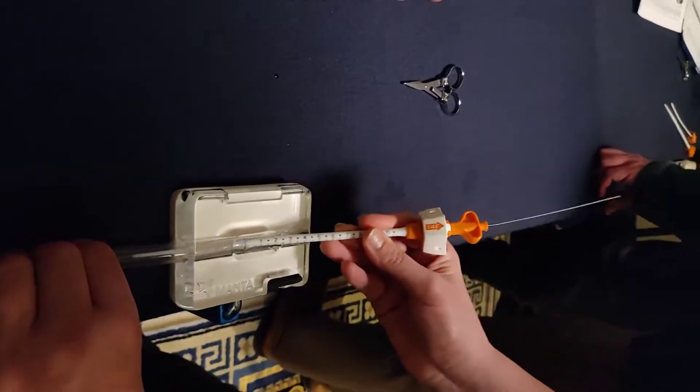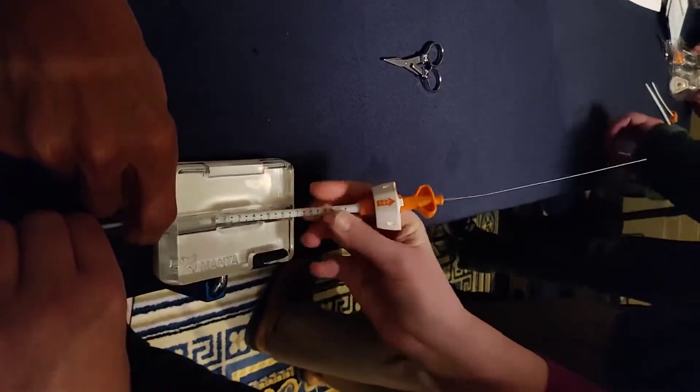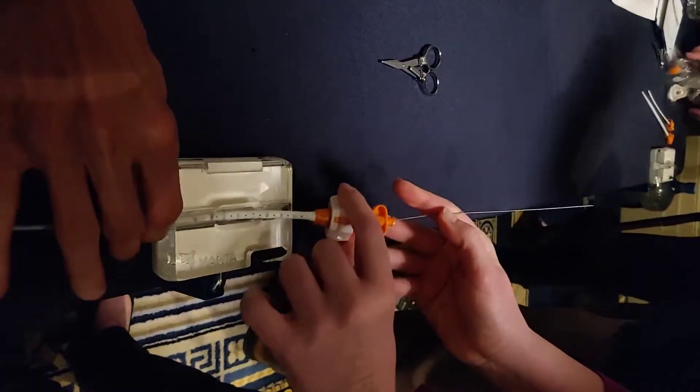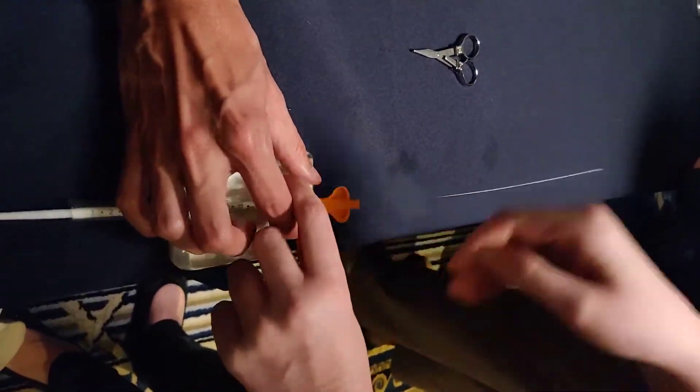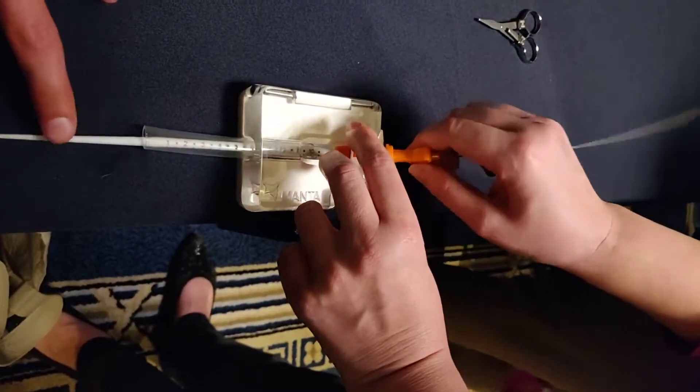Nicely done. You're gonna insert that all the way up to the hub. Exactly. Then yep, we're in quarter turn, remove that. I got your wire.